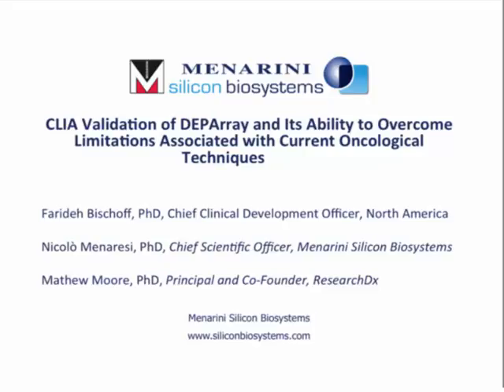Now, if you run 2 separate experiments on different days or different weeks, again, we have seen really high reproducibility. The results will be concordant for all of the major structural differences that you observe. So I hope that answers your question. But in our hands, different cells within the same patient will give you the same result, and that same patient run on different days with different kits with different technologists will give you the same result. Thank you, Matt.